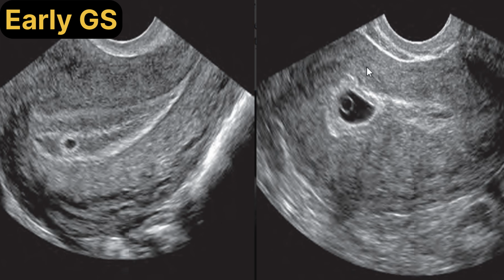This is a transvaginal image performed at 5 weeks, 6 days. It shows a yolk sac as an echogenic circular structure within the gestational sac, and the yolk sac is the first structure that is identified in the gestational sac of a normal pregnancy.